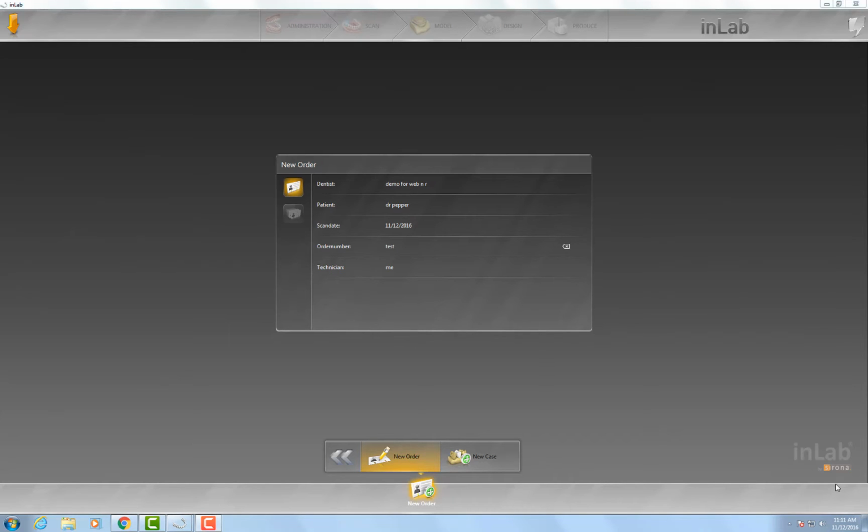When I first picked up the IPF software, it came to us with the scanner when we made our purchase. I was kind of fearful of it because I wasn't a removable person. I didn't know what I was doing, and I really didn't understand partials. However, one of my technicians had the Air Force manual on partials, so I decided to pick it up and educate myself. I started realizing that partials are not that hard once I got into the software and the education of it.